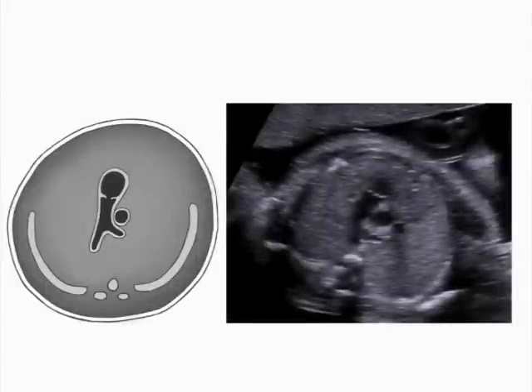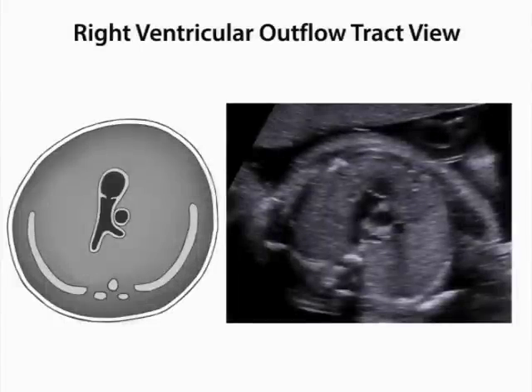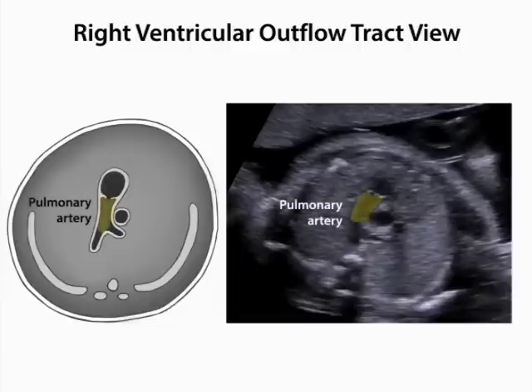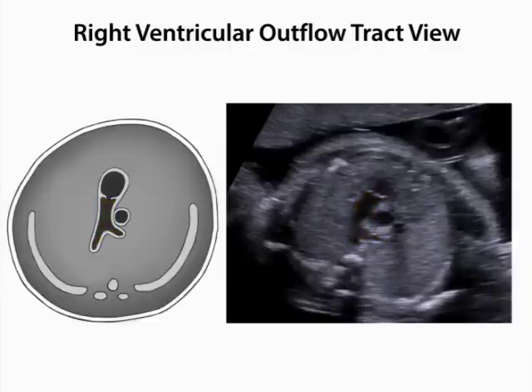Structures visible in the right ventricular outflow track view include the right ventricle, the pulmonic valve, and the main pulmonary artery. This main artery subsequently branches into the left and right pulmonary arteries. The ascending aorta is seen in cross-section and is perpendicular to the pulmonary artery in this view.